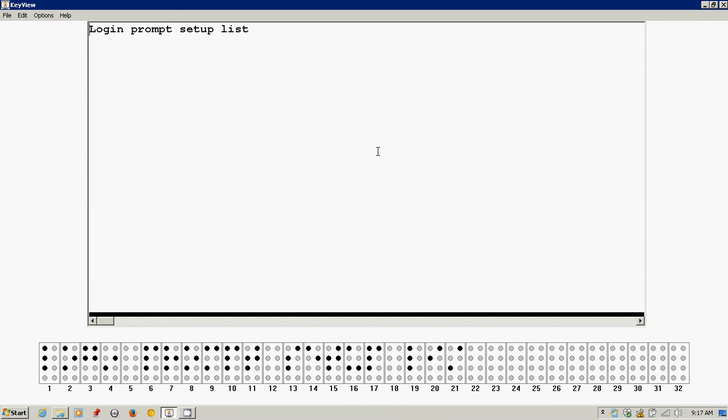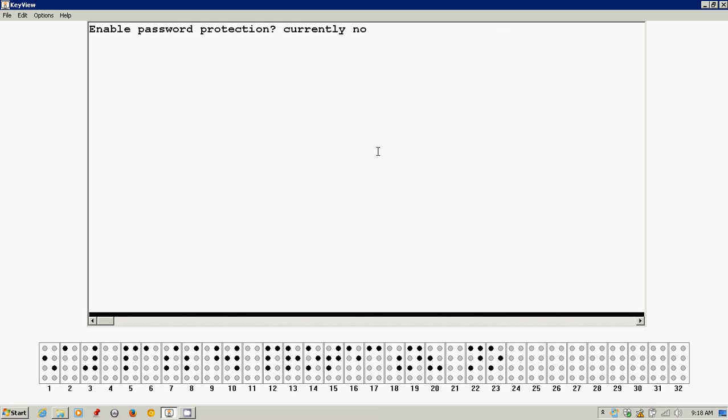Yes. Login prompt setup list. And it's asking me now to press space. I need to go down the list to see what options I need to set up. So I'll press space. Enable password protection, currently no. So password protection is currently off. So I'm going to hit Y for yes to turn this on.